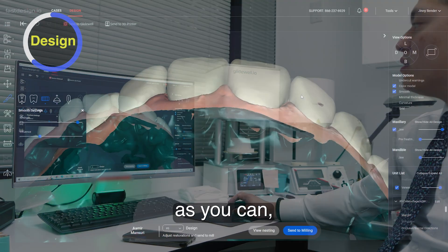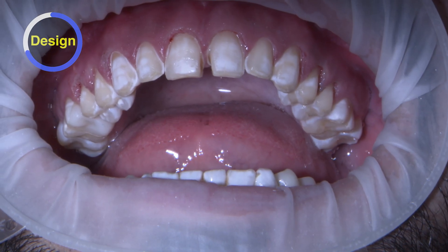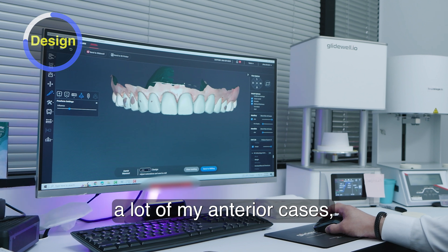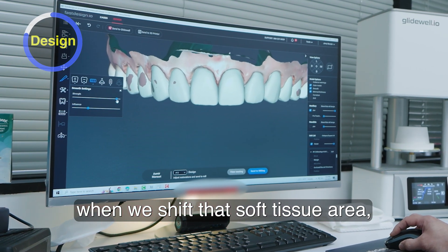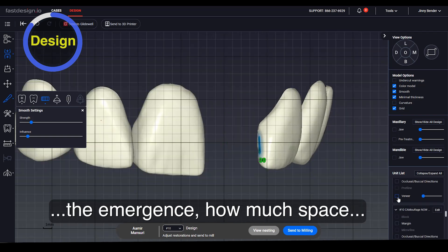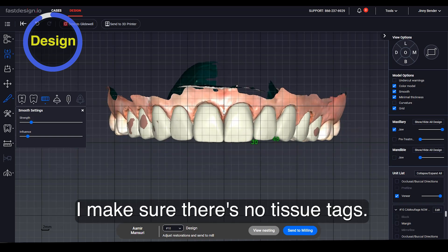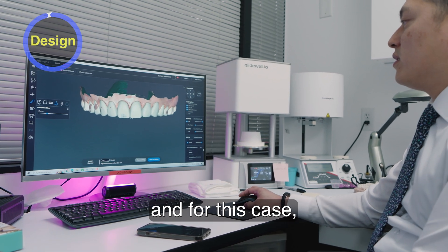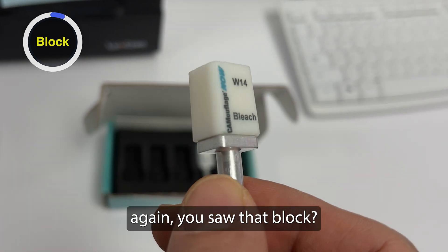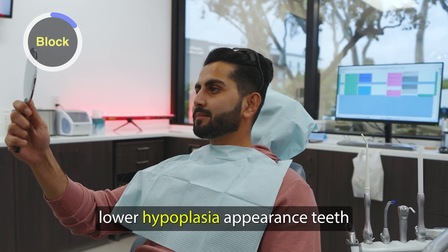You want to check from as many different views as you can — starting from the facial, then lateral views. For this case, I actually didn't pack cord. Sometimes when I do pack cord on anterior cases, shifting that soft tissue drops the papilla, and I get unsure of where to position the emergence — how much space, whether there are black triangles — and I can exacerbate those issues or end up with over-contoured zones. So before scanning, I make sure there are no tissue tags and all finish lines are visible. I prepped the margins equigingivally. We then mill these out in camouflage — a camouflage bleach shade that is super white, but it actually matched his lower hypoplasia appearance teeth really well.